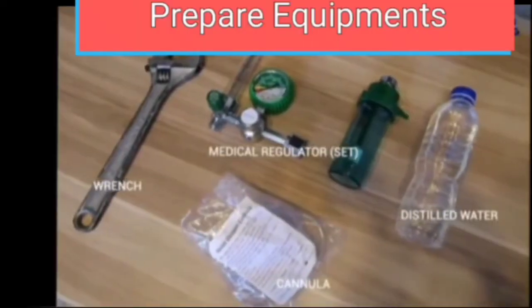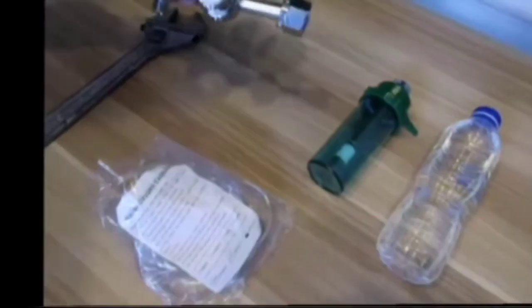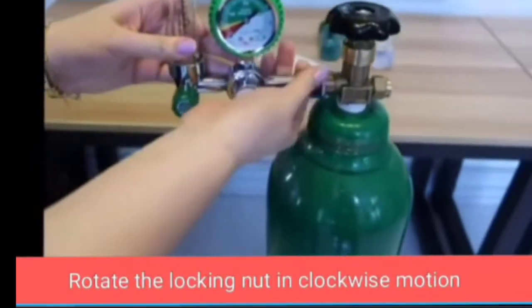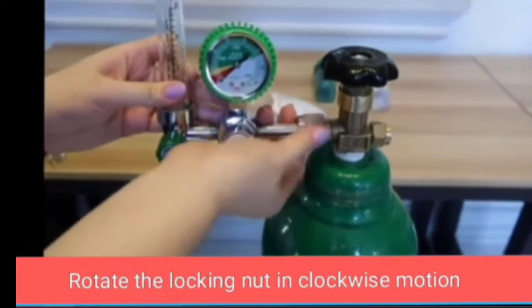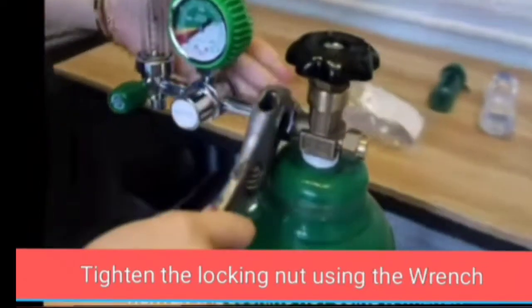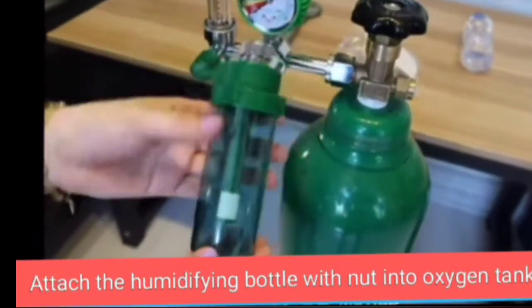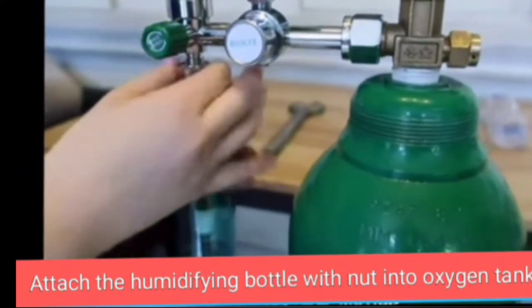Prepare a wrench, medical regulator set, distilled water, and a cannula. Attach the oxygen flow regulator to the oxygen tank. Rotate the locking nut in a clockwise motion. Tighten the locking nut using the wrench. Attach the humidifying bottle with nut into the oxygen tank.